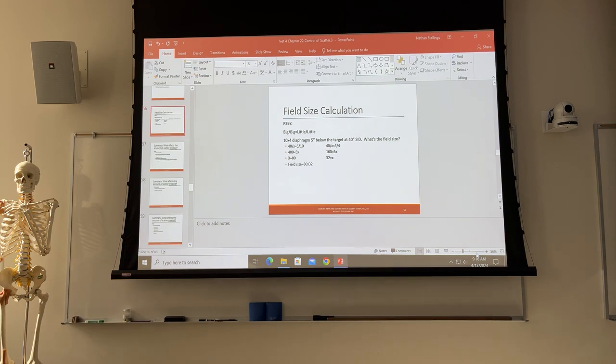In most cases, all the ones I've ever seen were extension tubes. But there are cones, like what you're seeing in figure 22.12, and most of your old timers, if you run into somebody who's actually worked with these, will refer to both of those as cones. And that's kind of where if you had a tech tell you to cone down on something, use that for collimation? No? Okay, so if you're working with a really old tech, you may hear somebody say cone down, and that just means collimate. That's all it means.